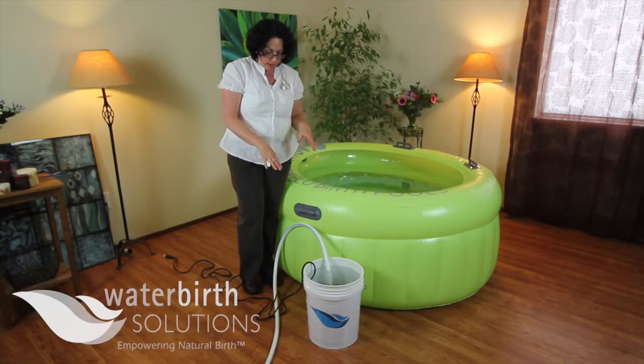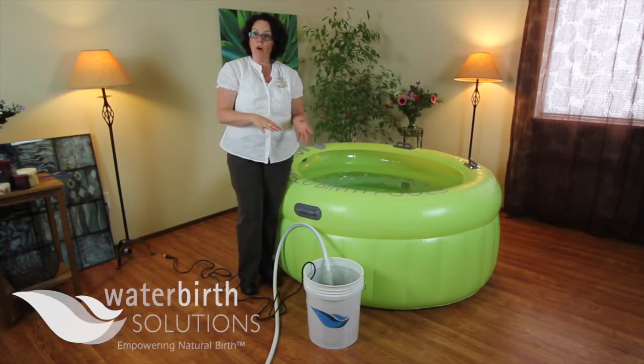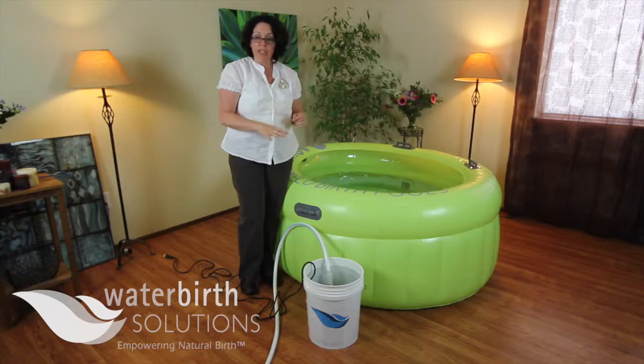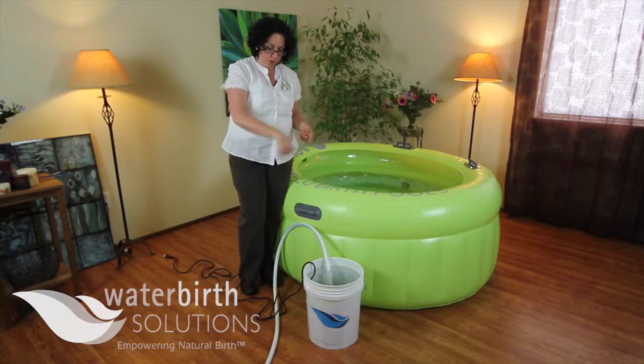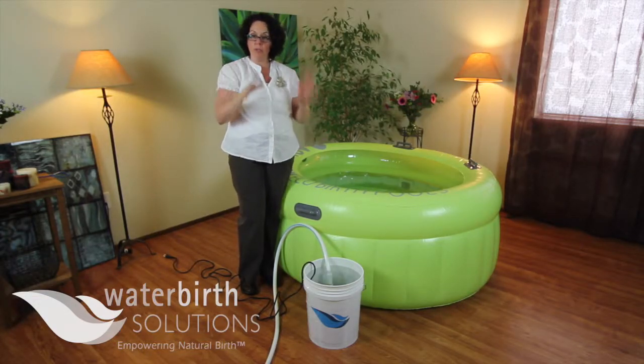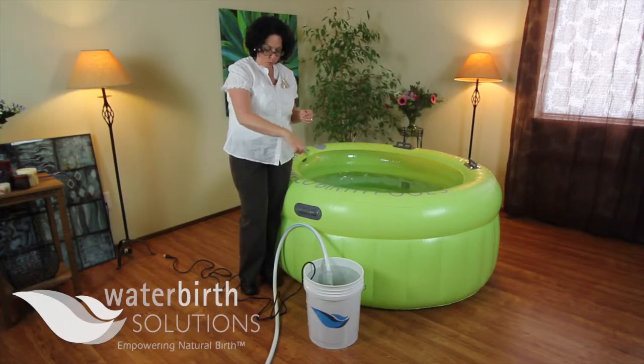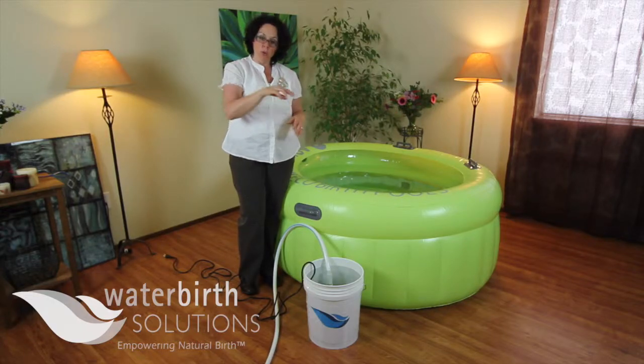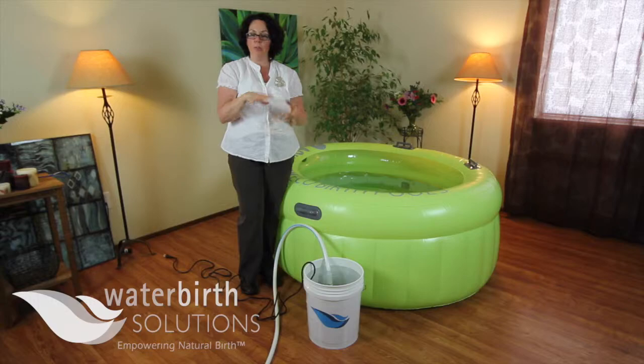Once this bucket is empty, I'm going to fill the bucket back up with some water and a 1% bleach solution. And then I'm going to take the hose and coil it all up. We're going to cut away and come back to show you the hose totally curled up inside the bucket. The whole purpose of that is to allow the hose and the drain pump to be recirculated with the 1% bleach solution. We will come back in just a second.